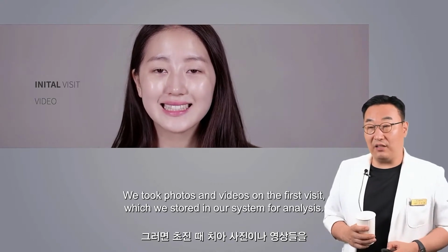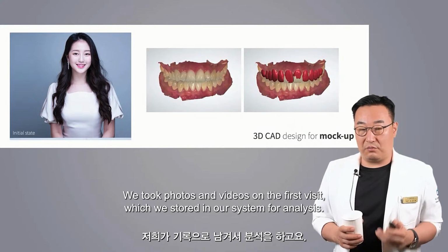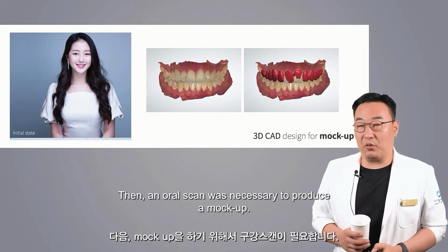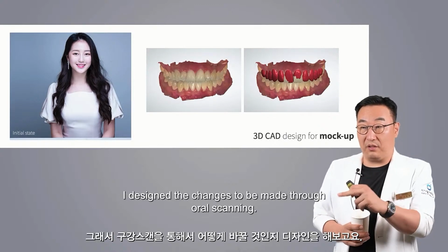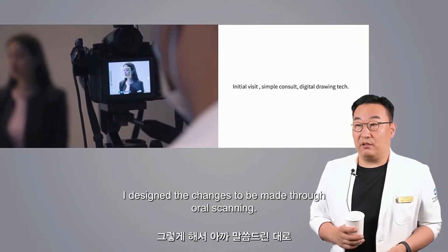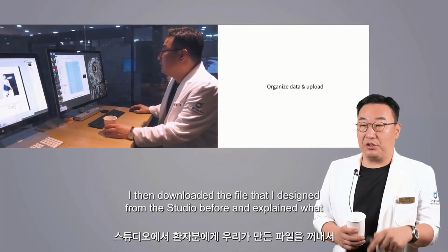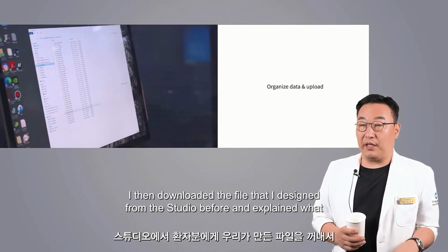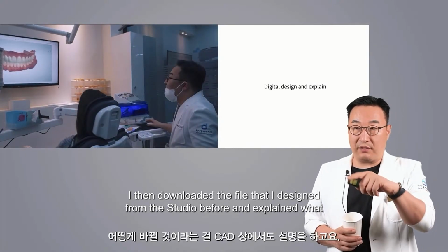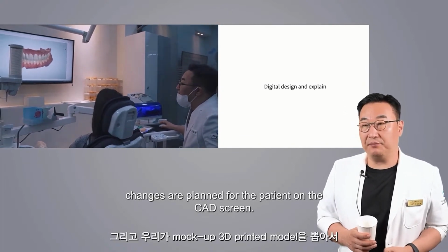We took photos and videos on the first visit, which we stored in our system for analysis. Then, an oral scan was necessary to produce a mock-up. I designed the changes to be made through oral scanning. I then downloaded the file that I designed from the studio before and explained what changes are planned for the patient on the CAD screen.